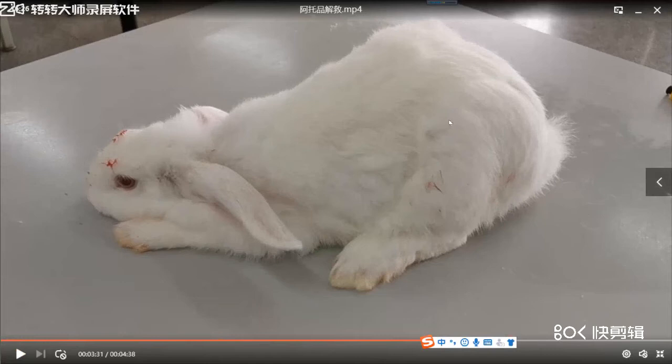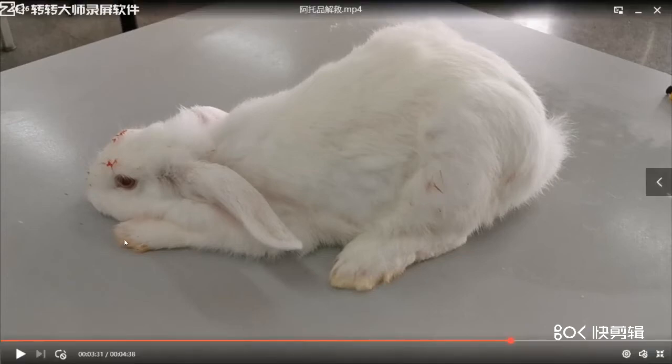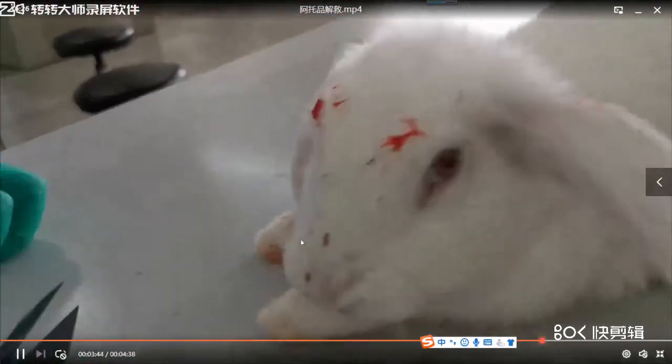Have you seen? So that means we use two special antidotes. Atropine mainly relieves the M signs and symptoms, and PAM chloride mainly relieves the N signs, paralysis. Okay. And after we inject both drugs, let's observe the symptoms again.